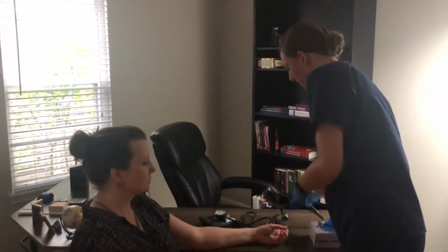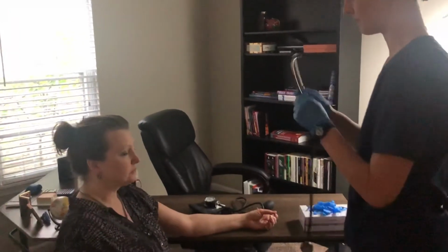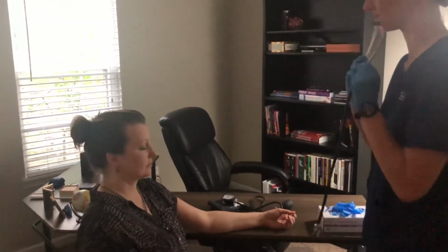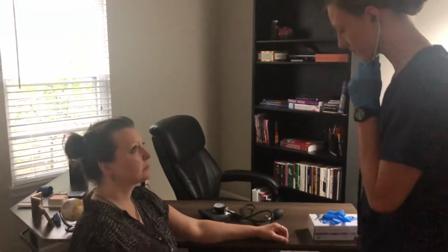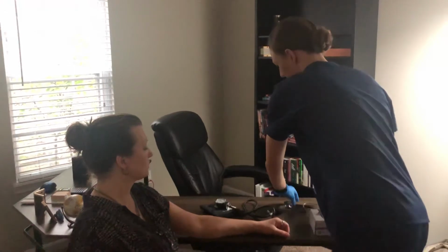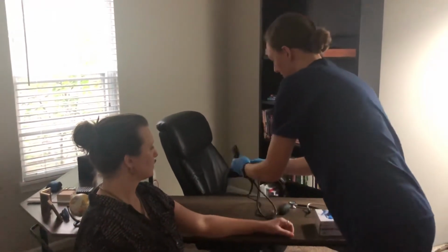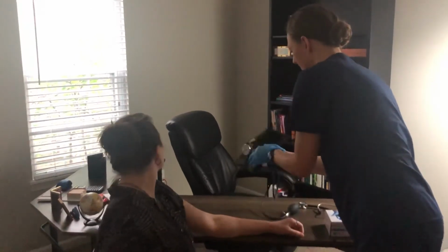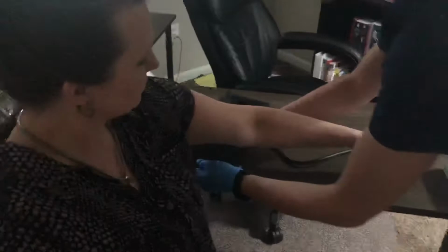Now I'll be taking her blood pressure, Dr. McCafferty, or Renee. I'll put that on first. Okay, just relax your arm.